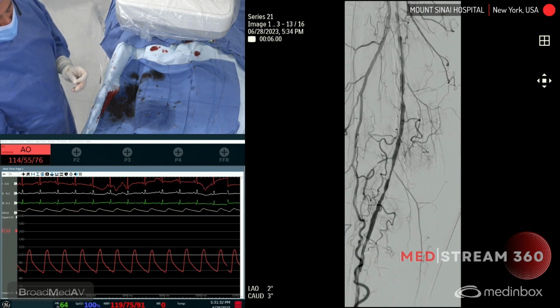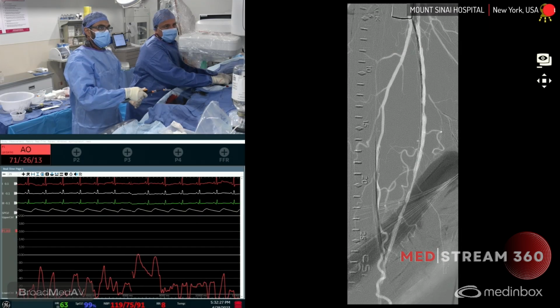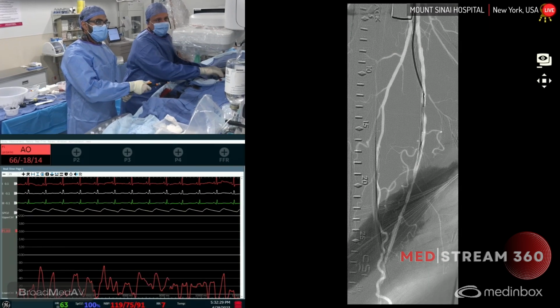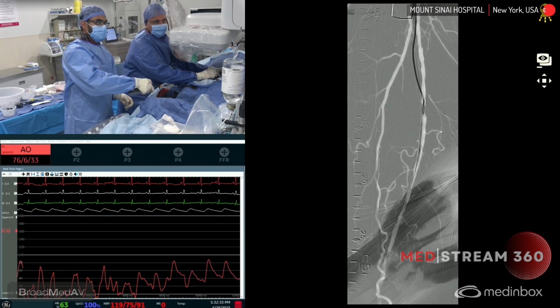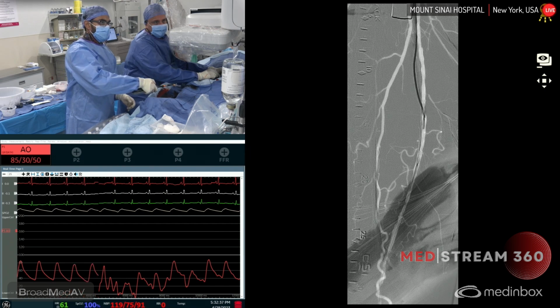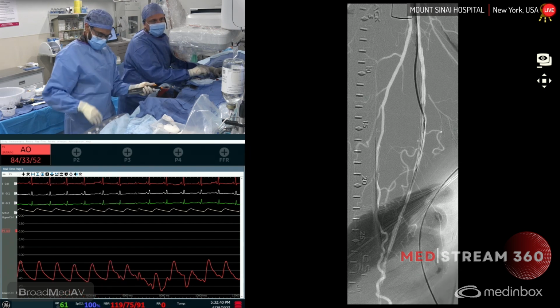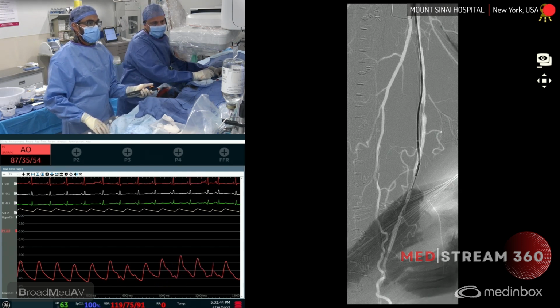And I'm only going to cut the areas that are occluded. I'm really not going to go crazy here. So I'm coming down. I'm just going to pick the quadrant I want to cut. Okay, I'm cutting medially here. Turn it on, please. So I'm just going very slow. Off. I'm going to stay in that quadrant. I'm going to come down to here. On, please.